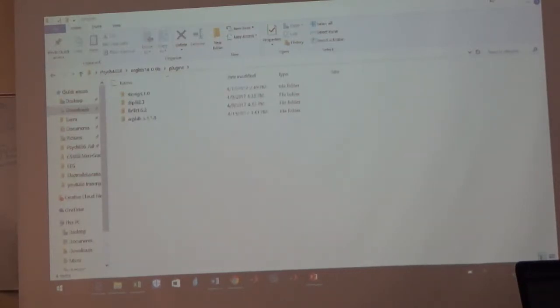So you might want to keep notes on the steps. Okay, good. Have notes on how to do what we're talking about.